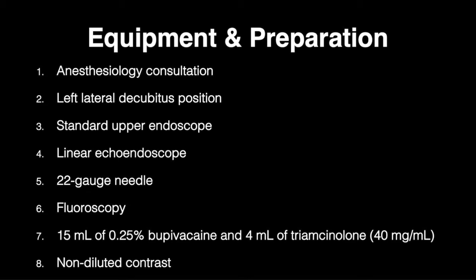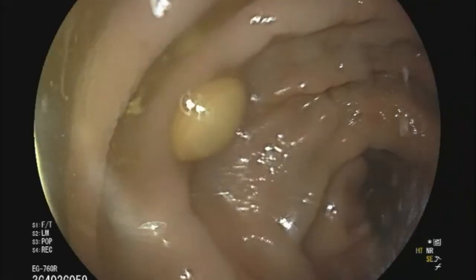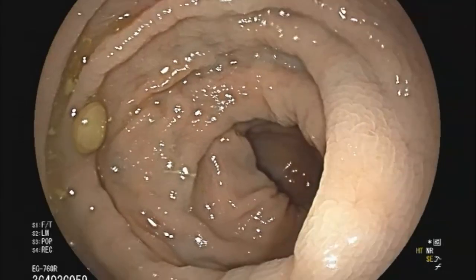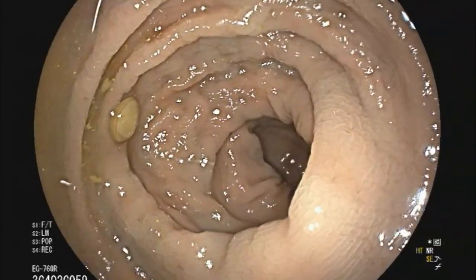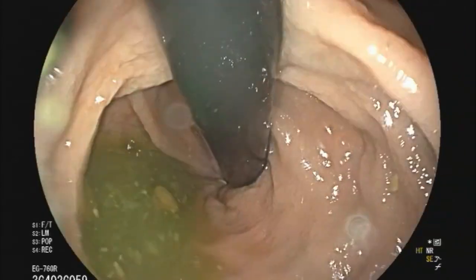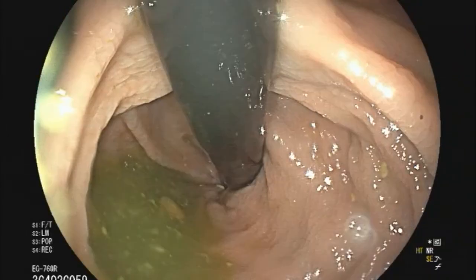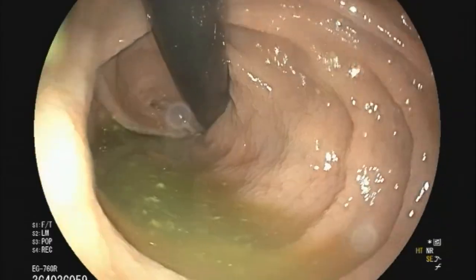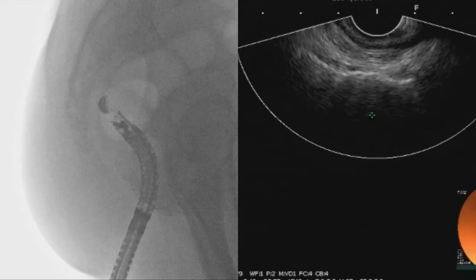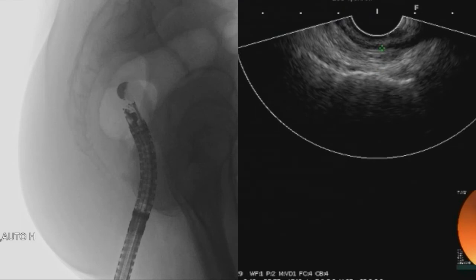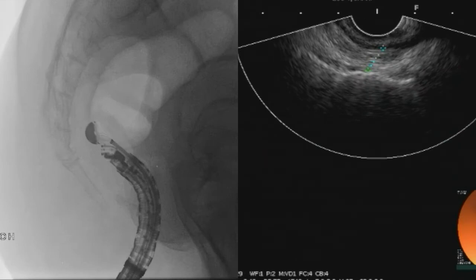First, flexible sigmoidoscopy is performed under white light to confirm the lack of clear pain drivers and to evaluate for visible lesions. Next, an echo endoscope is introduced into the rectum with the transducer oriented in the posterior direction to locate the position of the sacrum and coccyx.